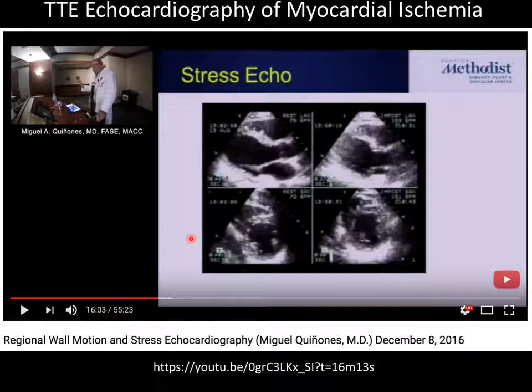And so the heart itself starts to beat a little bit faster, somewhat faster, but it contracts with much more vigor. And what this does is it raises the demand for blood, and then if the demand is not met, you will see that the first thing that happens is the wall motion, the increased contractility of that piece of tissue, will drop. It'll stop contracting. And it looks quite obvious when it happens.